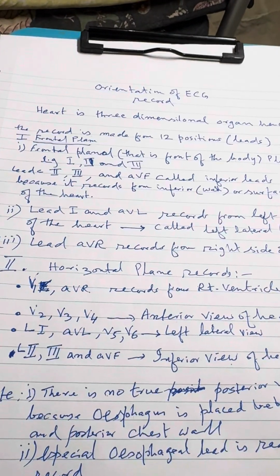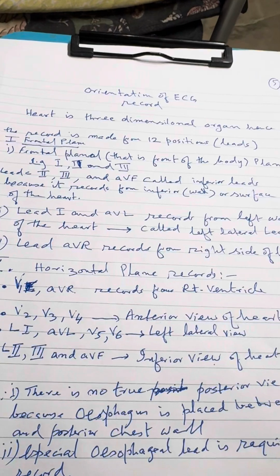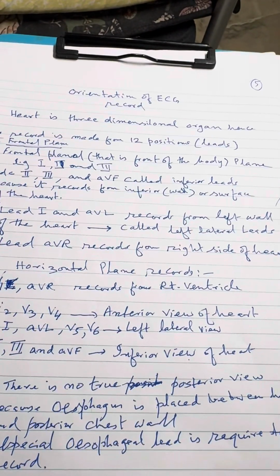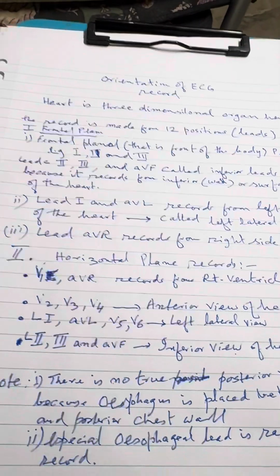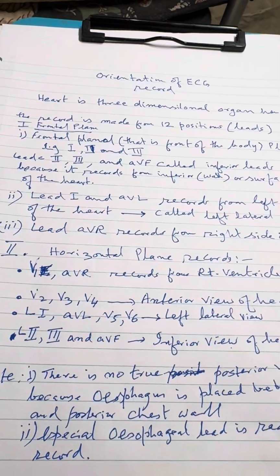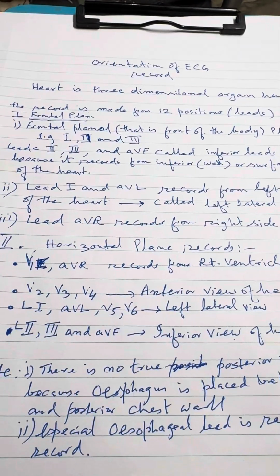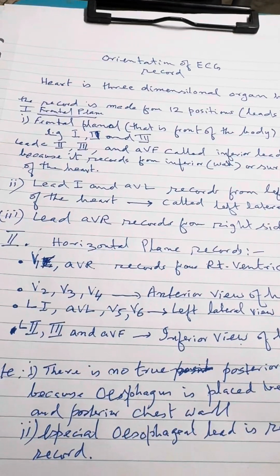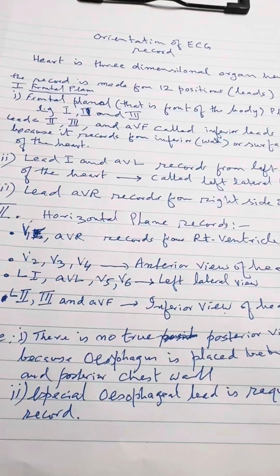Then lead 2, lead 3 and AVF is recording the activity from the inferior side of the heart. So this is the orientation. Remember, this is a very important point to keep in your mind. Which recording is recording from what part of the heart.